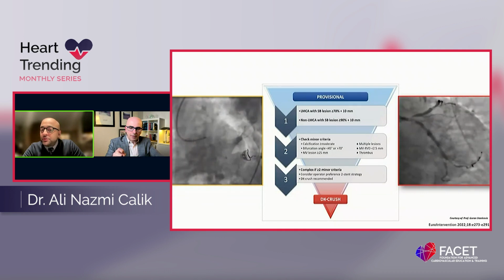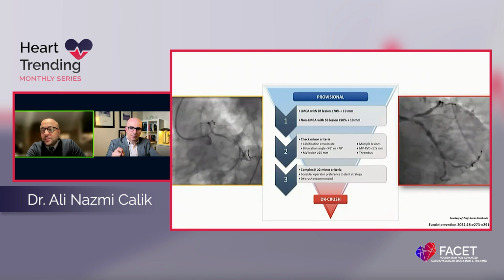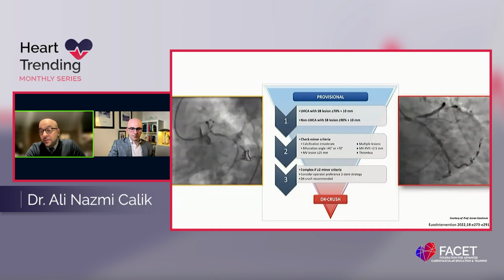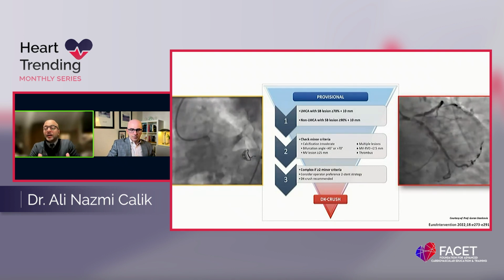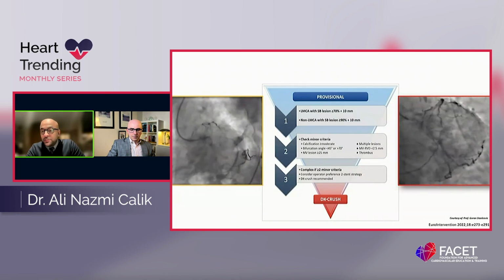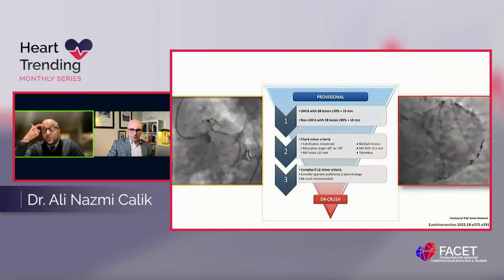Of course. It is really important to understand because angiography has its own limitations while evaluating the calcium burden. Of course, it doesn't provide us with adequate information about the calcium burden. Of course, if you have an intravascular imaging in your cath lab, you should use it if you are dealing with a left main patient particularly. It will not only provide you with the vessel size, you can also assess your PCI result or the morphology of the plaque, whether it is calcific or thrombotic, or what is the burden of the calcium.